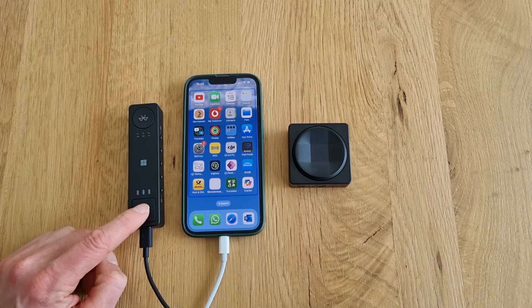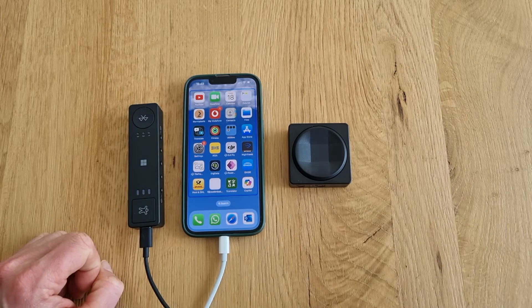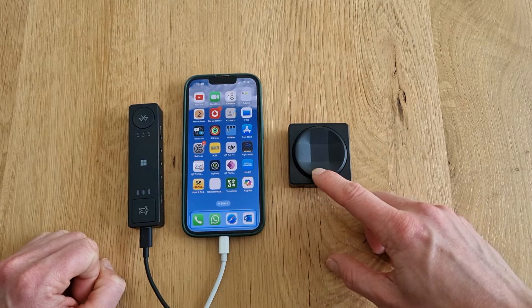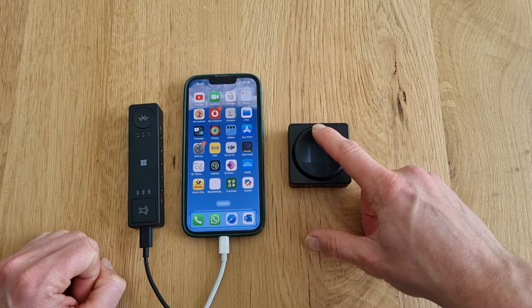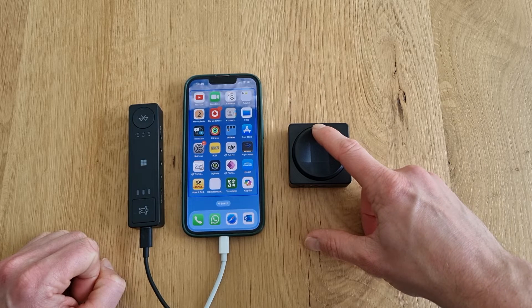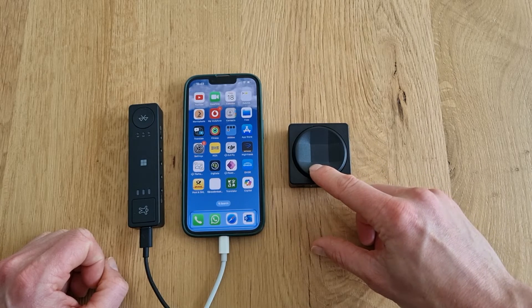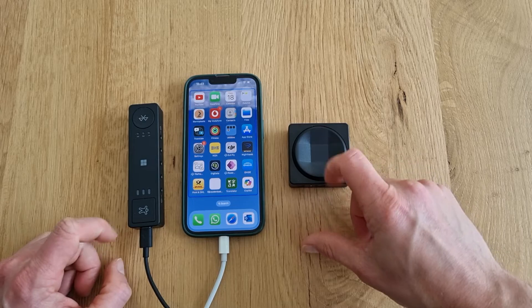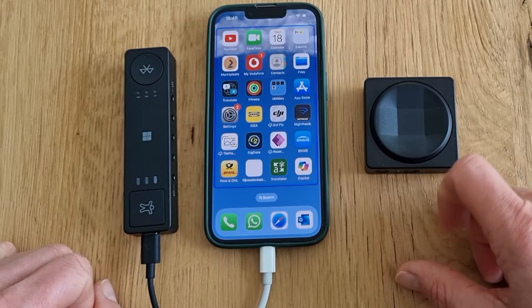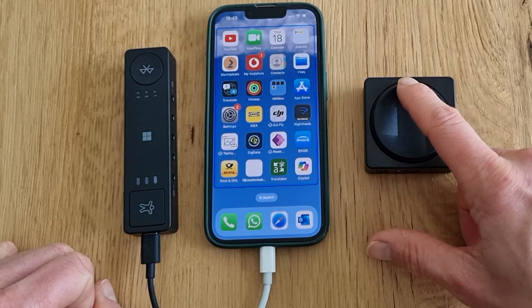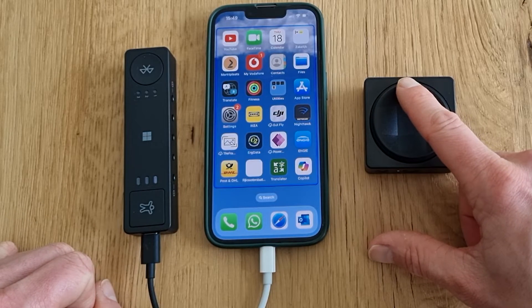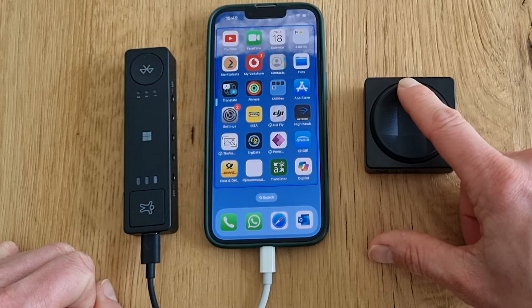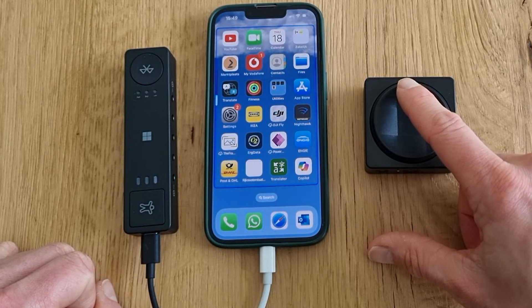So going back to profile 0, the d-pad simply allows me to navigate. But switching back to profile 1, the d-pad up button allows me to increase volume. Remember that changing profiles can be done on the hub, but also with an external or adaptive button.